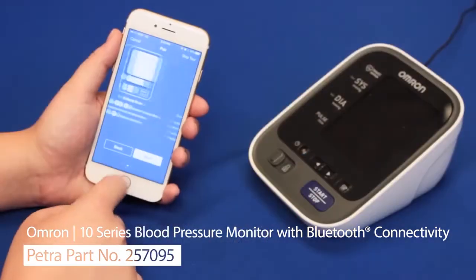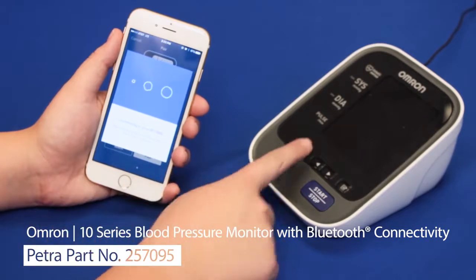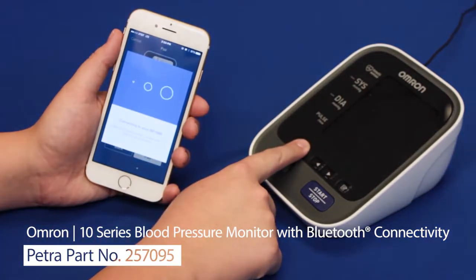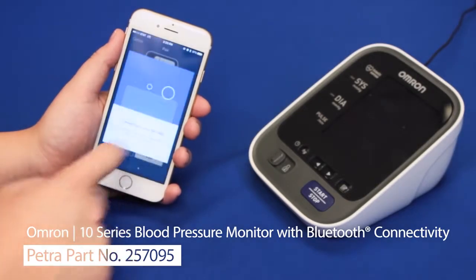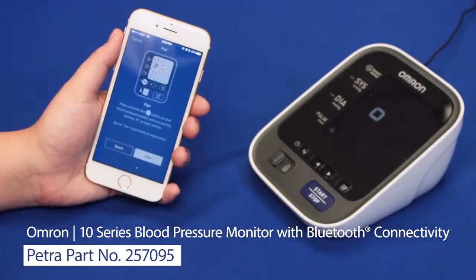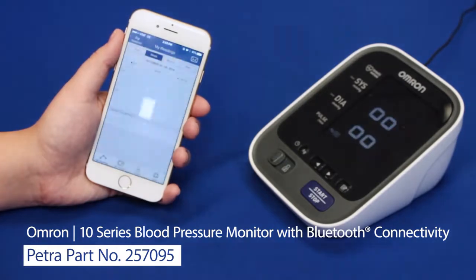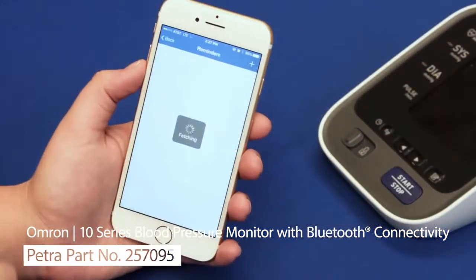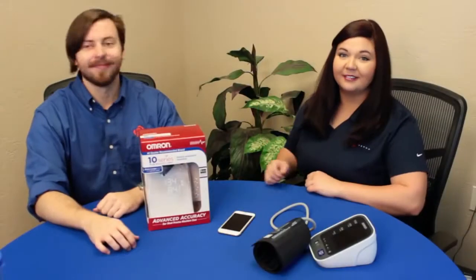This monitor also works with the free Omron Wellness app, which is compatible with most smartphones. Using Bluetooth to sync or pair the smartphone with the monitor, readings can be saved to the Omron cloud and shared later. Just follow the easy step-by-step instructions on the app to move the readings from the monitor to the cloud. Hit the transfer button, and you can create reminder notifications that it's time to take readings again.